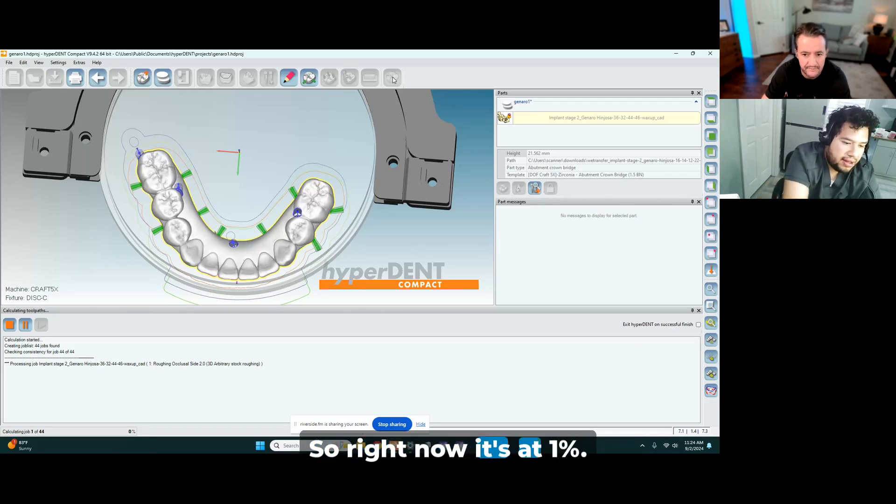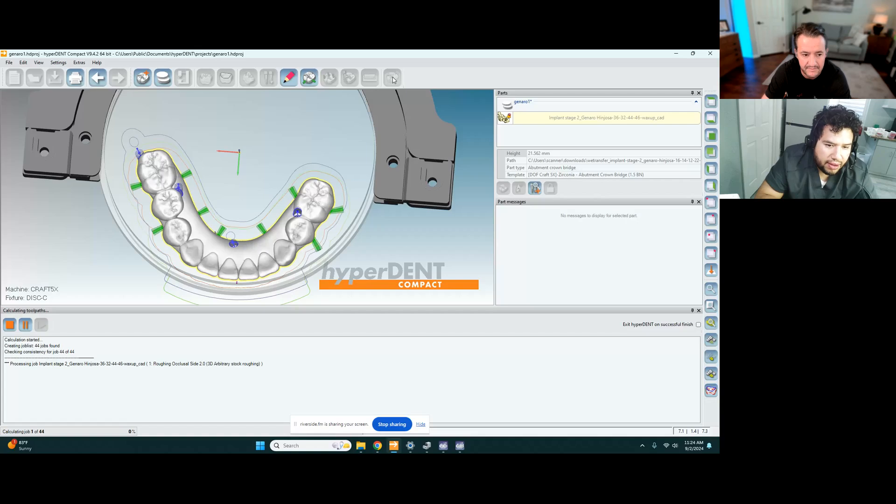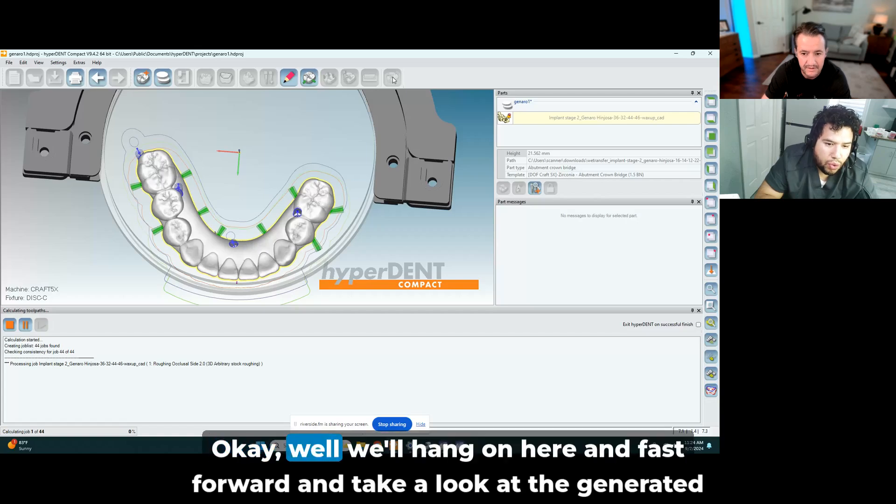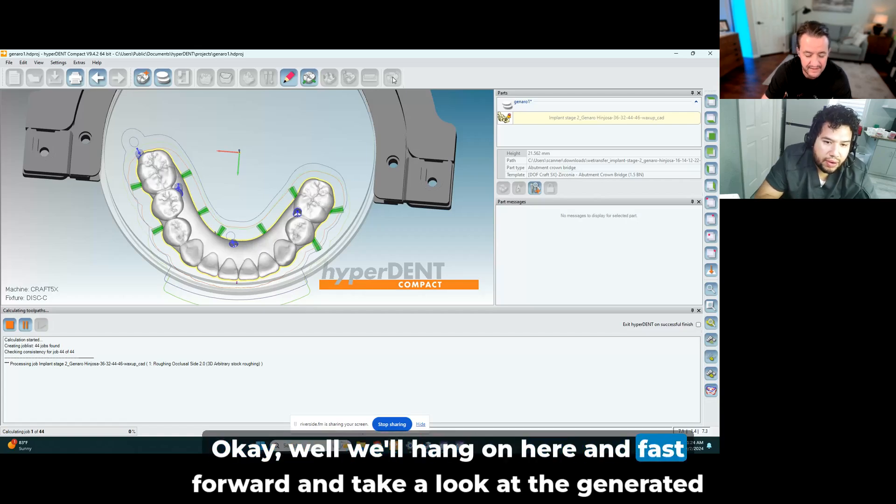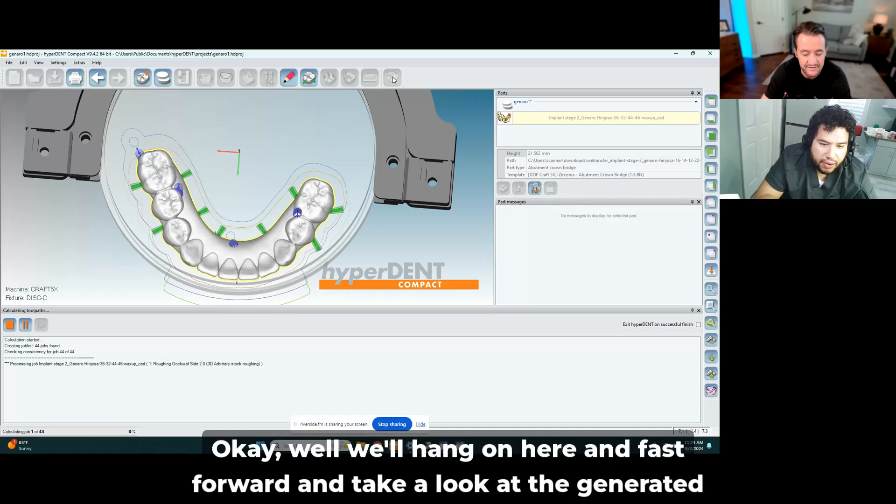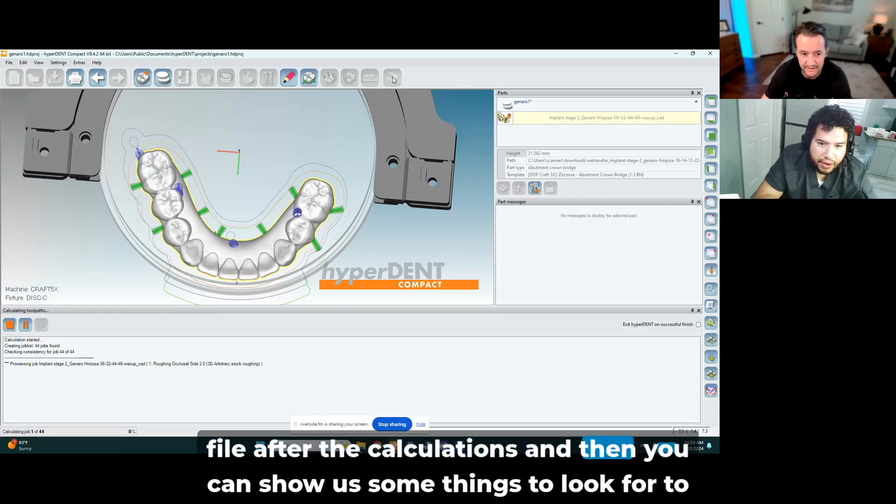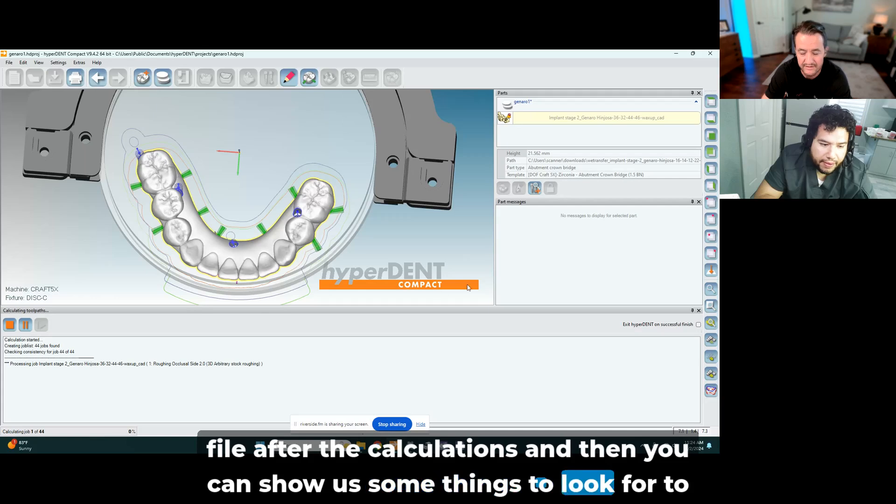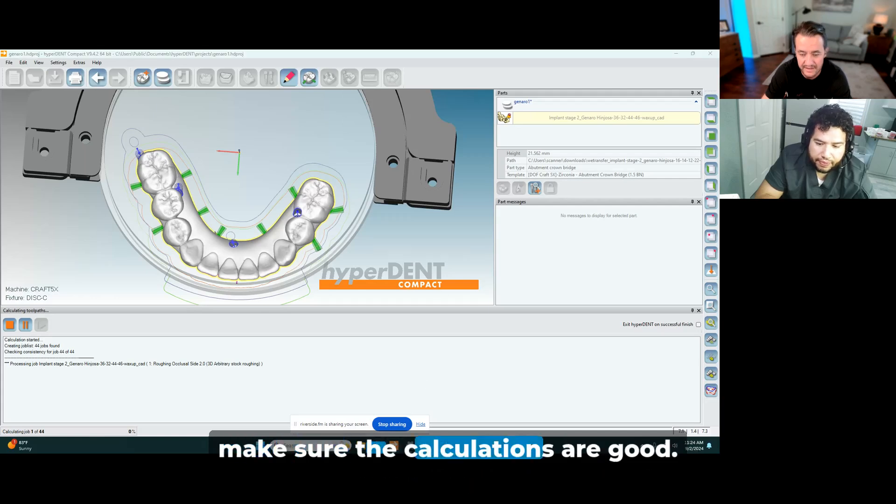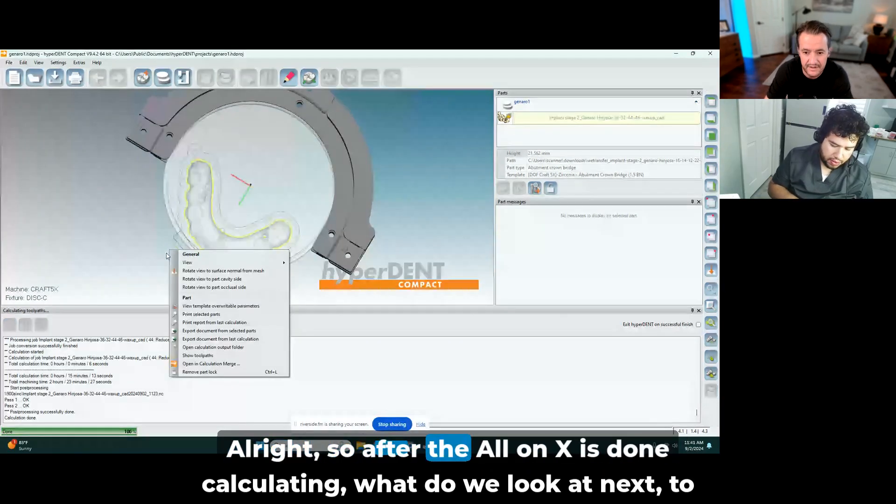So right now it's at 1%. Okay, well we'll hang on here and fast forward and take a look at the generated file after the calculations, and then you can show us some things to look for to make sure the calculations are good.